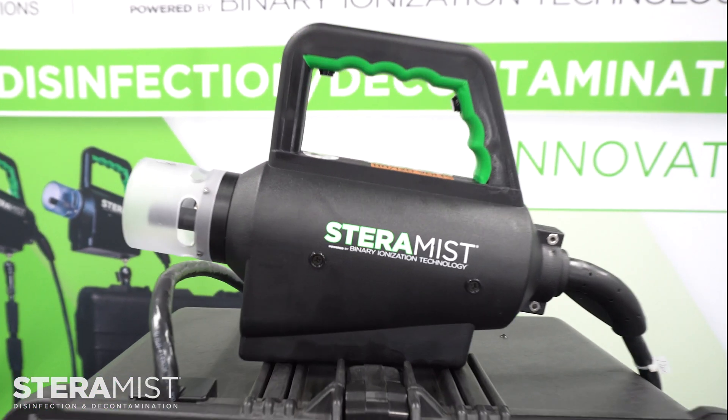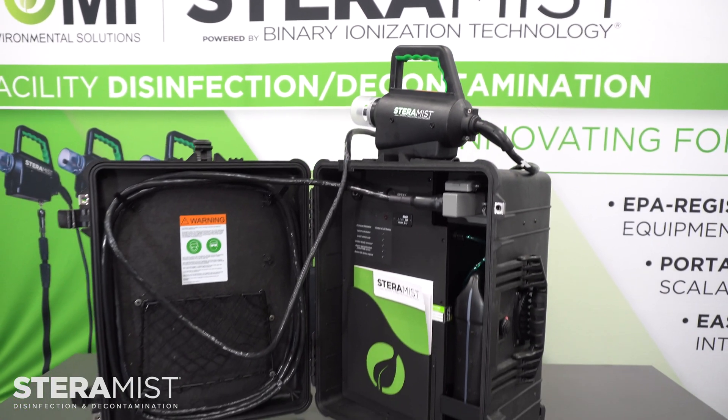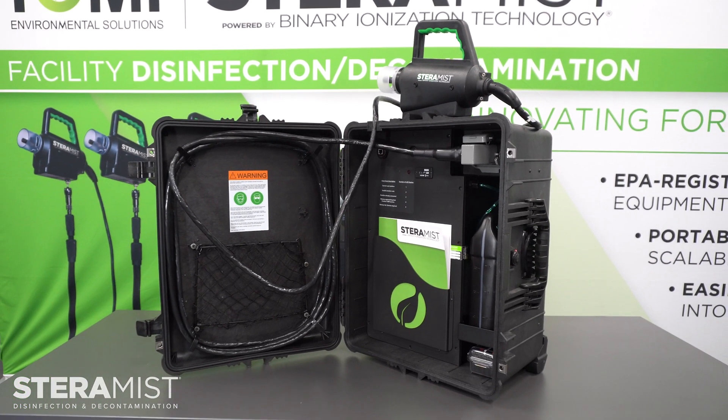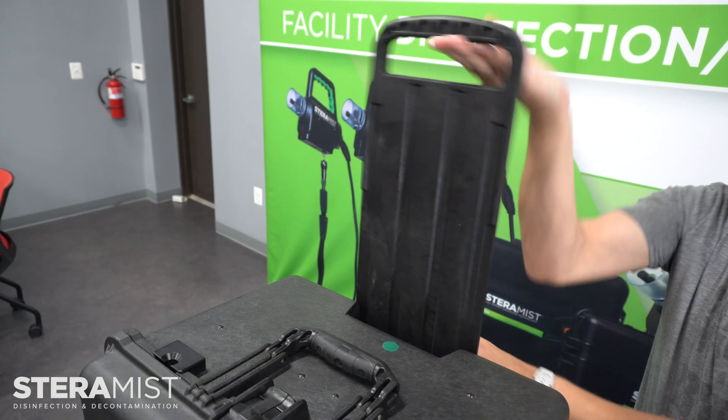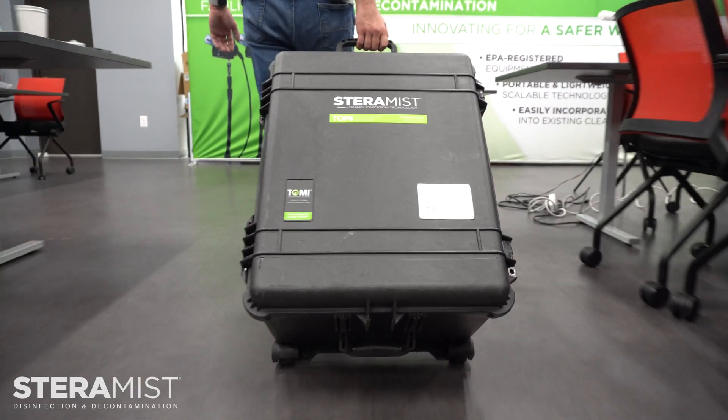Introducing the Stara Mist Surface Unit — premier disinfection packed in a convenient hard case, ready to be deployed at a moment's notice. With a comfortable handle and wheels, it is ready to be taken anywhere you need disinfection.